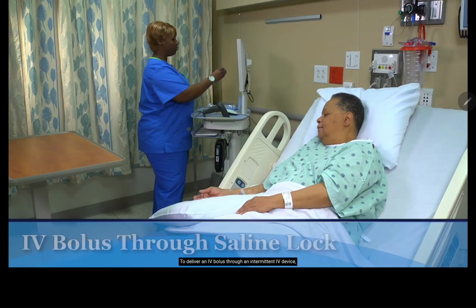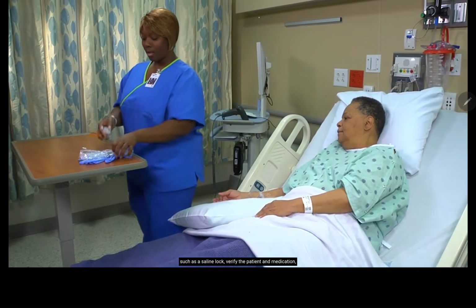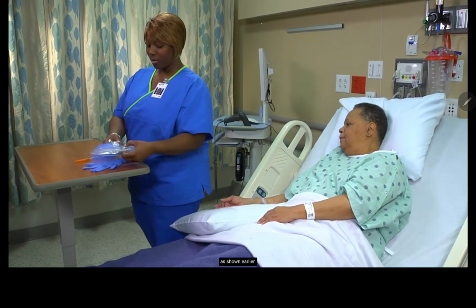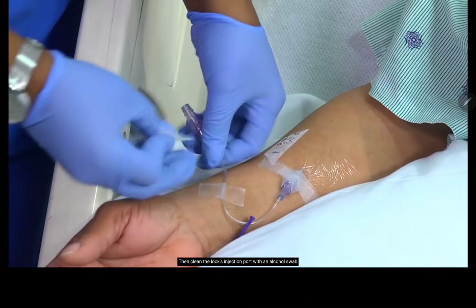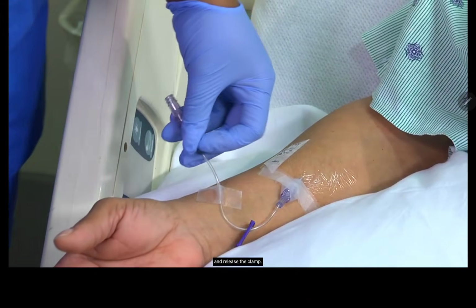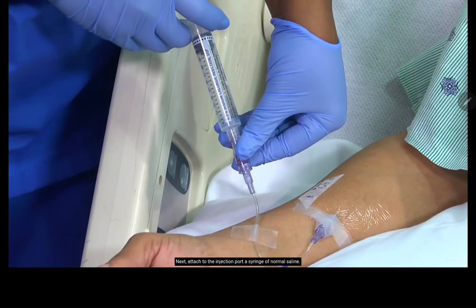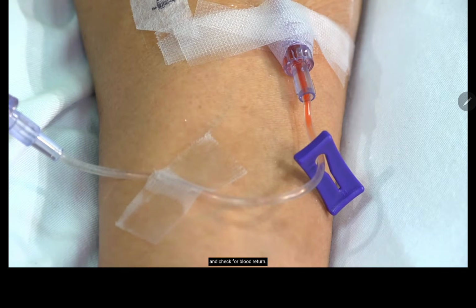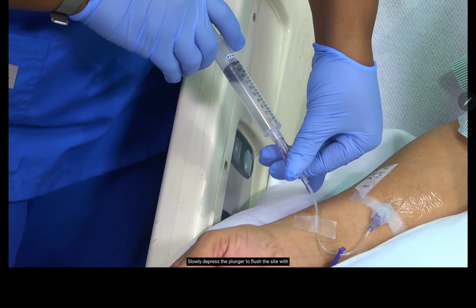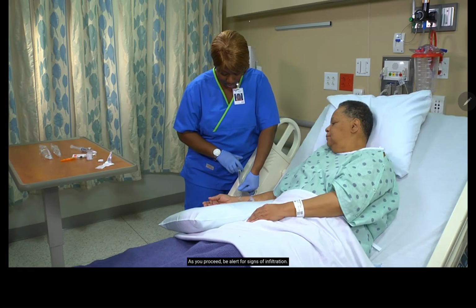To deliver an IV bolus through an intermittent IV device, such as a saline lock, verify the patient and medication as shown earlier. Then clean the lock's injection port with an alcohol swab and release the clamp. Next, attach to the injection port a syringe of normal saline. Pull back gently on the plunger of the syringe and check for blood return. Slowly depress the plunger to flush the site with 2 to 3 milliliters of normal saline. As you proceed, be alert for signs of infiltration.